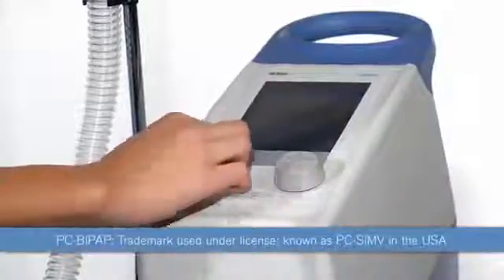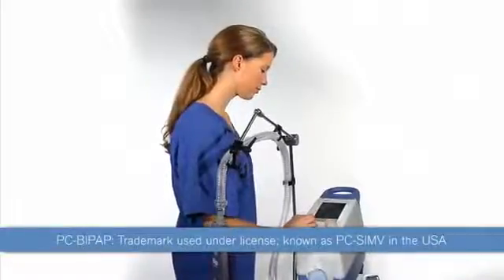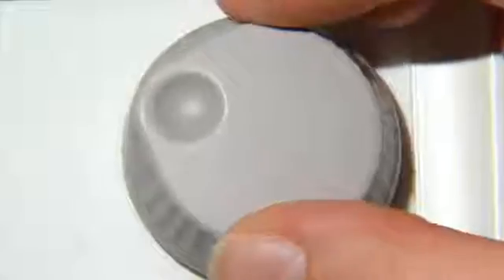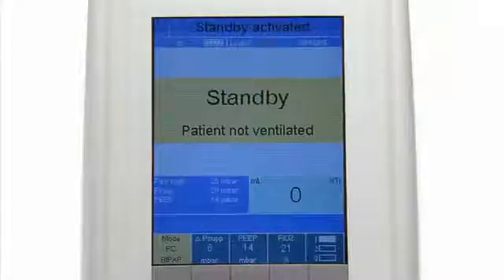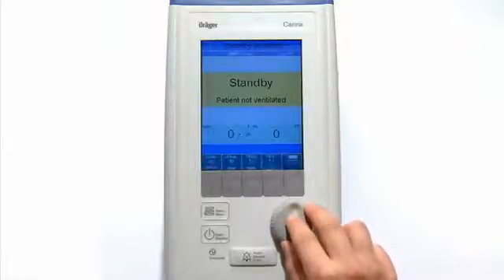Now set the mode to PC BiPAP. In the US, this mode is called PC SIMV. To do this, press the button below the set mode and turn the rotary knob until you see PC BiPAP. Then press the rotary knob to confirm your choice.